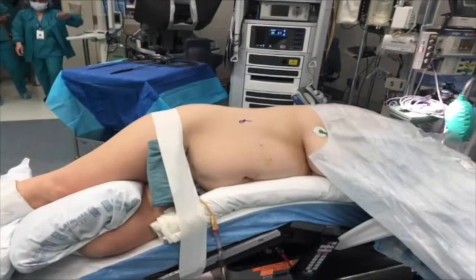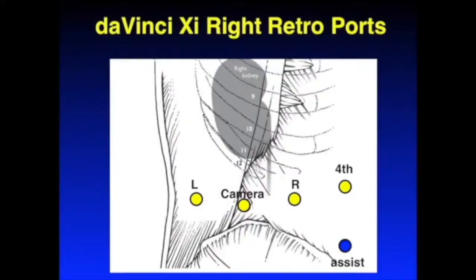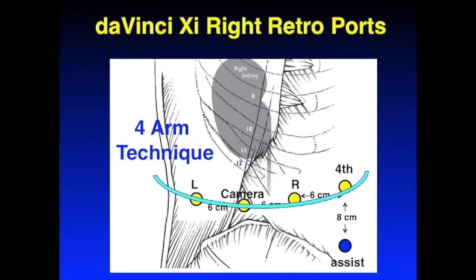Positioning for the retroperitoneal approach requires the patient to be in the full flank position and fully flexed. Port placement for the retroperitoneal approach using the DaVinci XI involves a linear configuration using four robotic ports with approximately 6 cm between the ports. The assistant port is placed anteriorly.